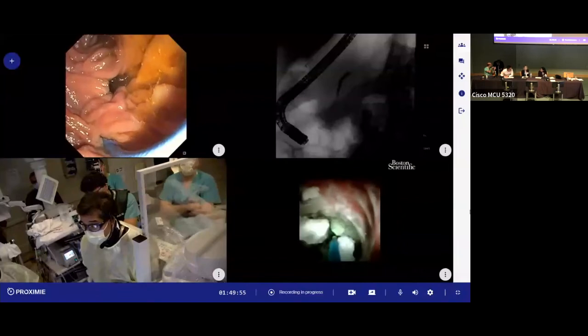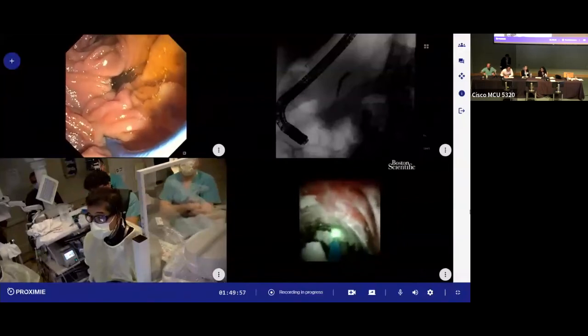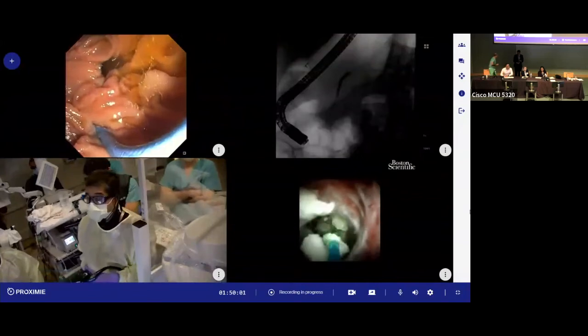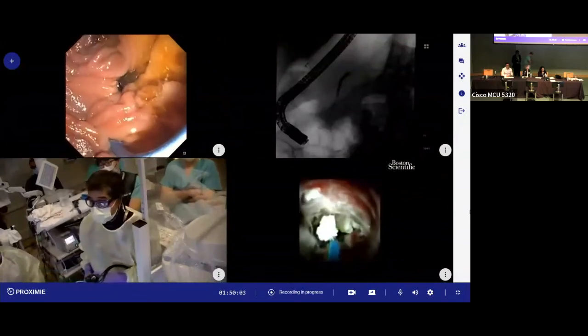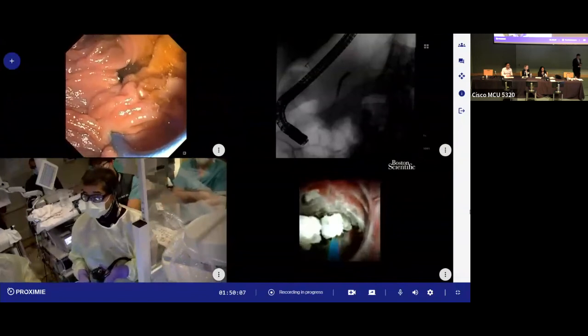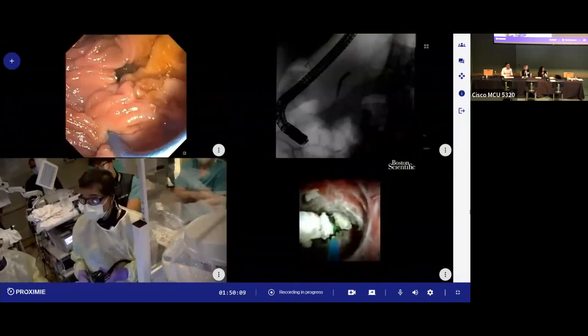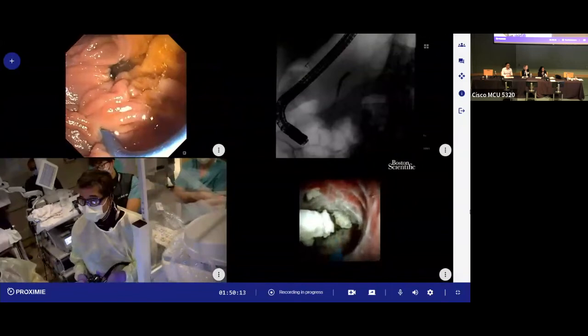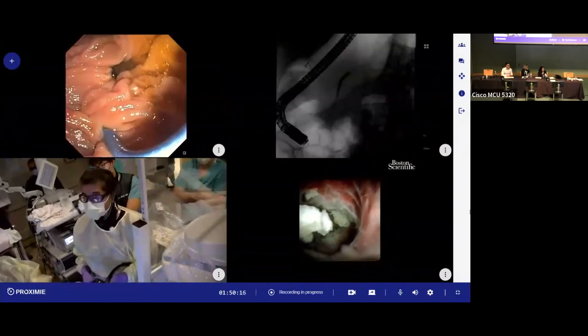So what I think we're going to do now, I think this is good with laser, right? If you guys want to hang around, we're going to take the laser fiber out, and then we're going to shoot some contrast. You can put the laser on standby. Oh, it's stuck again. You don't want to break it. There we go. Okay.